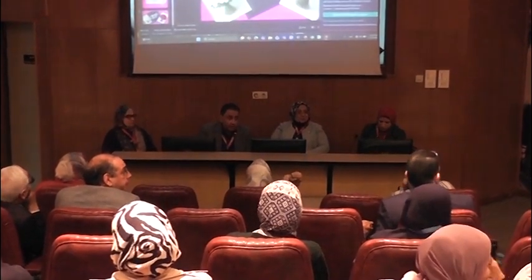Present Dr. Muhammad Shaab. He will talk about recurrent perianal fistula, endoanal ultrasound, comparison between biplane probe and 360-degree probe.